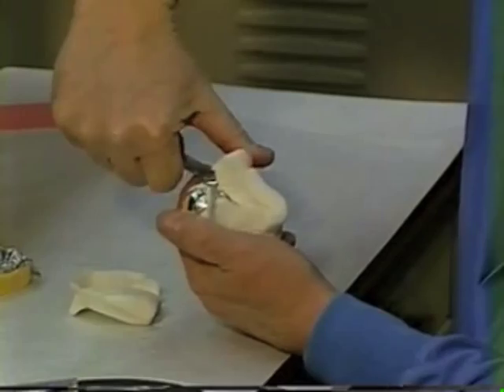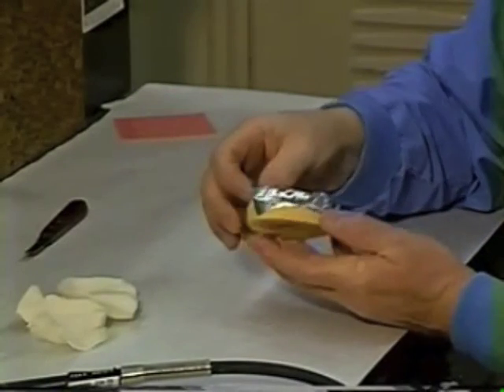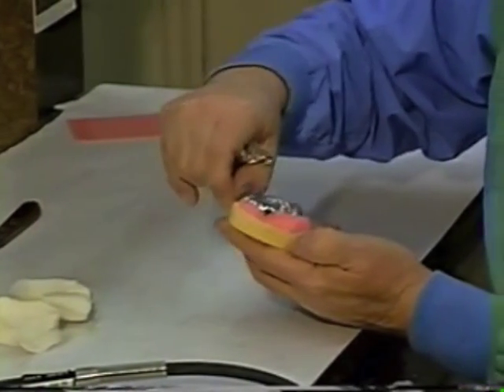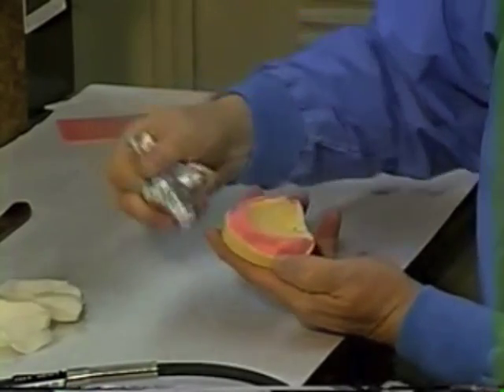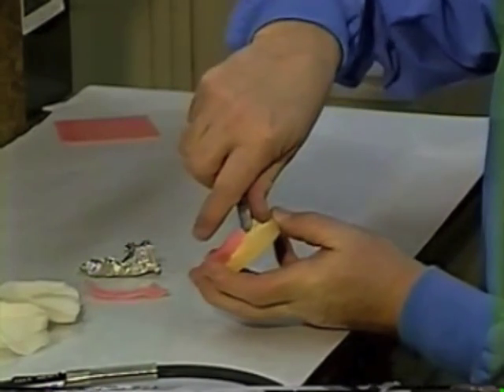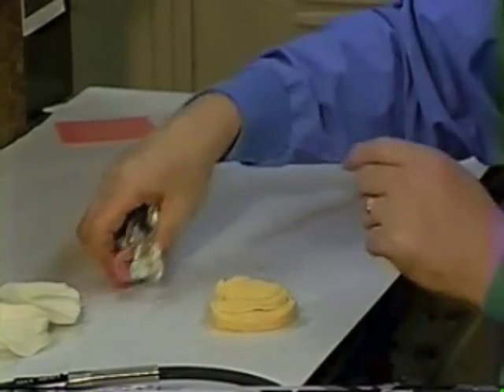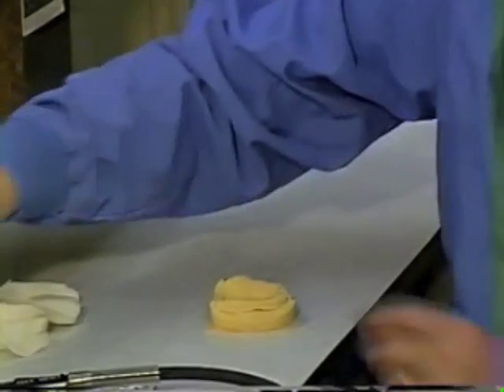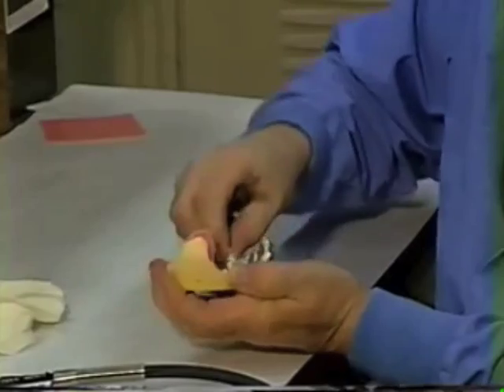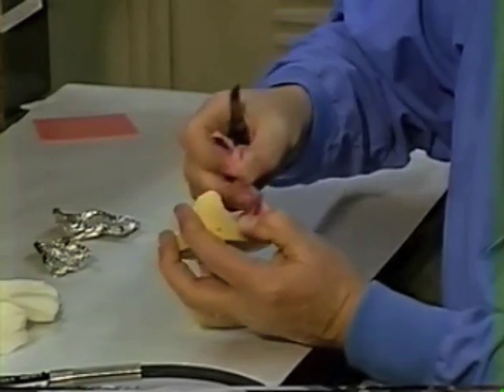Do the same with the mandibular tray — get under the edge and get it to lift up. Once both trays are off the casts, take the cast back and clean the tin foil off, then remove the wax relief so that you can expose the lines that were originally drawn on the cast.